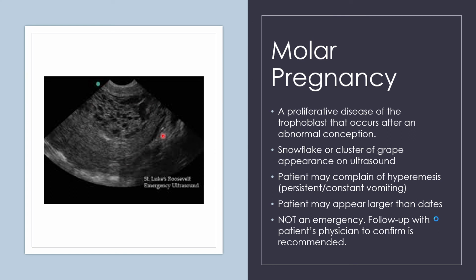There's lots of different things, but if you see lots of this in there, and usually the patient will look further along than they actually are, say they're supposed to be 10 weeks by their dates, but they actually are kind of showing on the outside. They get a little pooch, and you think, oh, they're probably further along than they think. If you put the transducer down and you see this, that is a molar pregnancy, okay?